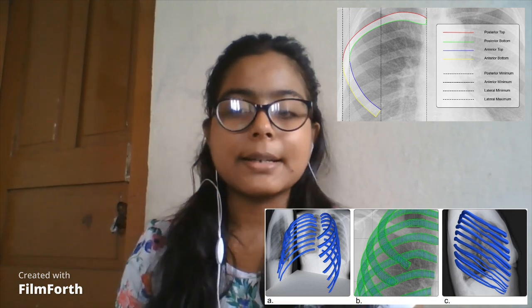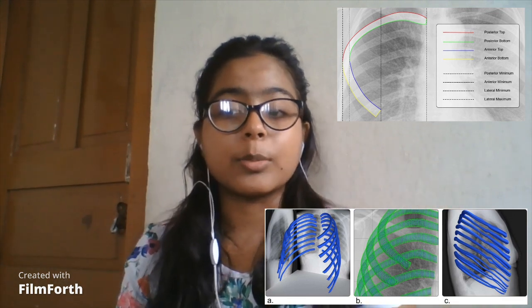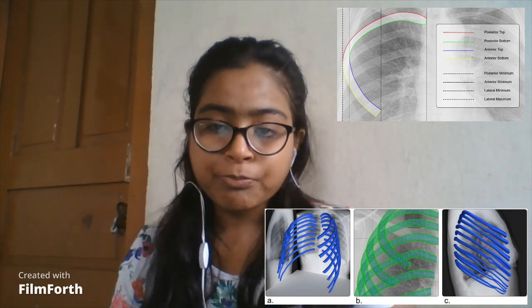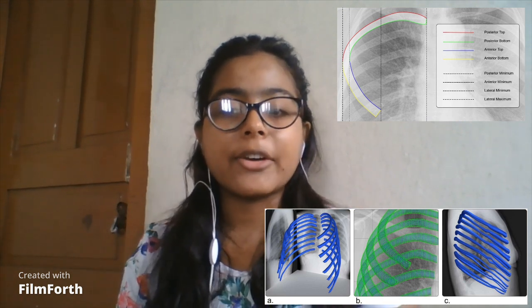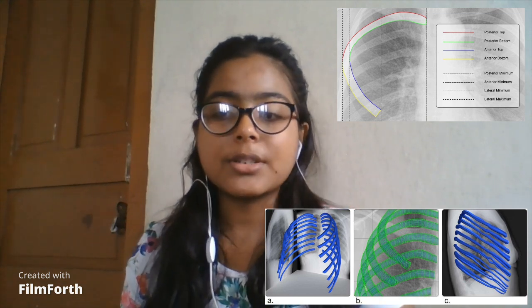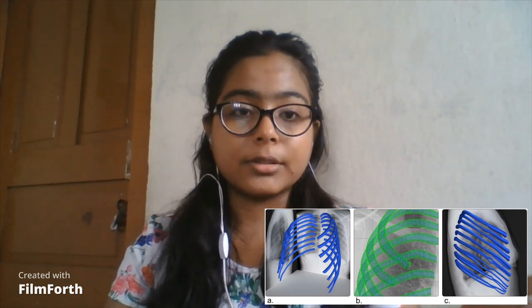The anterior subclusters are transformed in a similar way. Due to the fact that the maximum and the minimum vertices of the subclusters in the lateral cluster do not necessarily lie in the border of the 3D model when it is projected onto the XY plane, the entire lateral group is translated along the y-axis all at once so that it lines up with the lateral maximum anchor points. This process is shown in the figure.